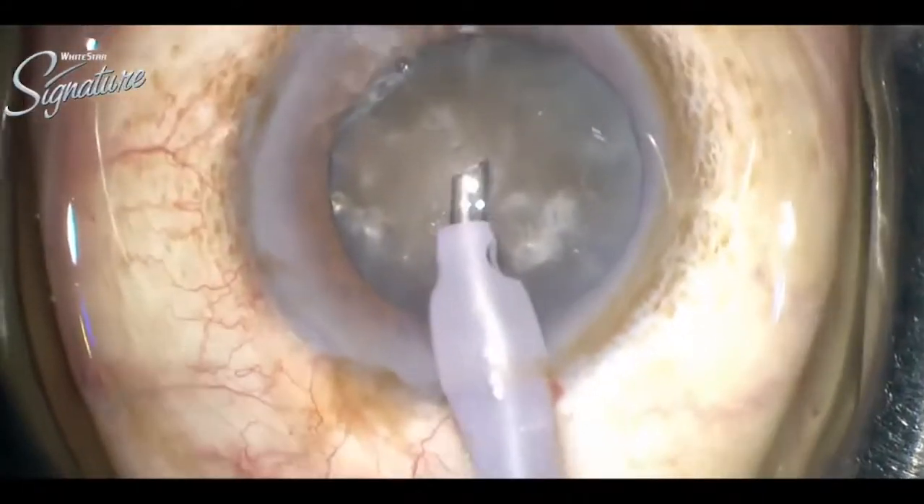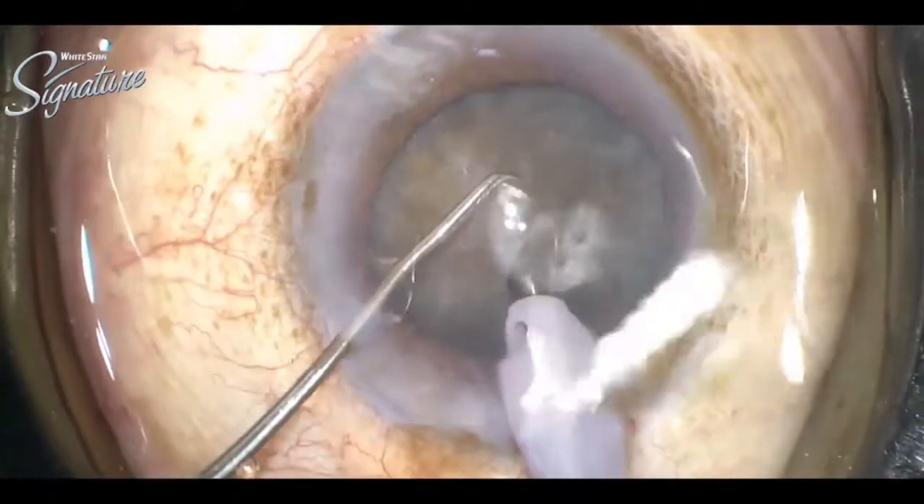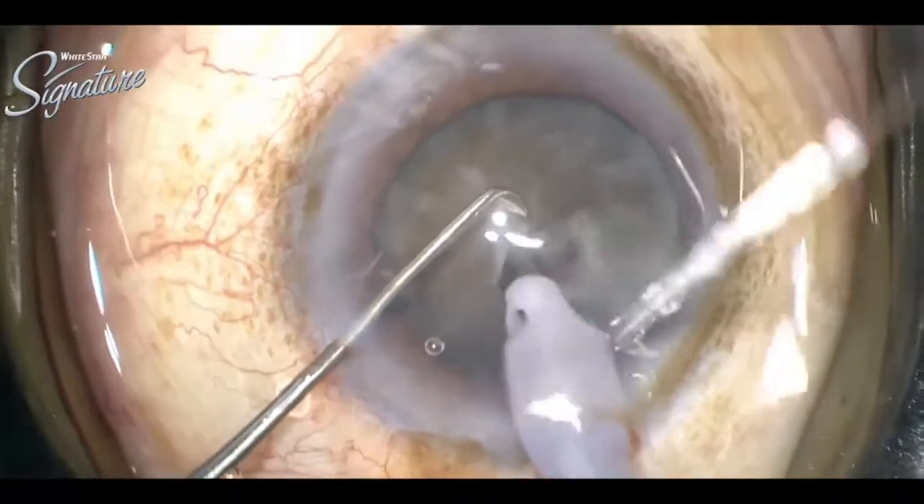As we can see, the lens rotates nicely in the bag, then under cover of this viscoat which protects the endothelium nicely, we can proceed for phaco.